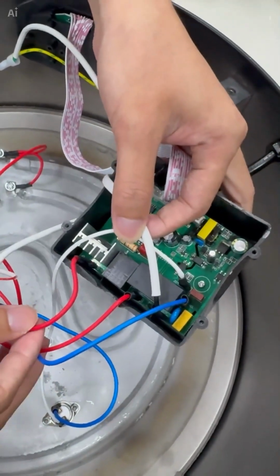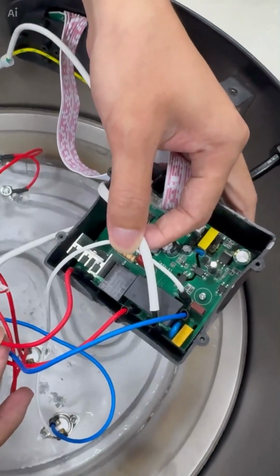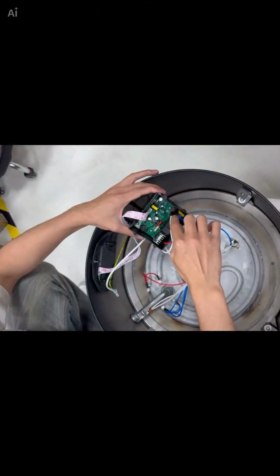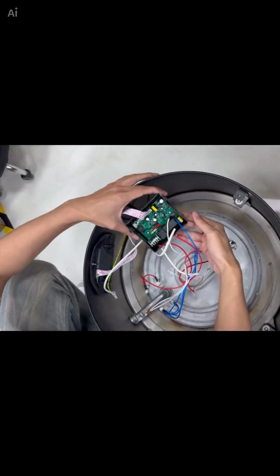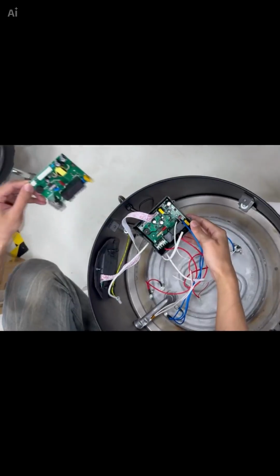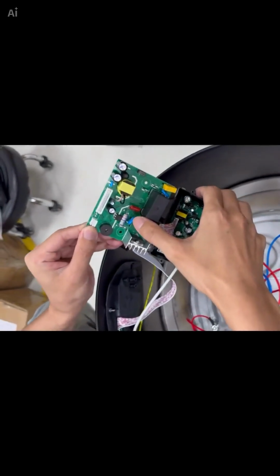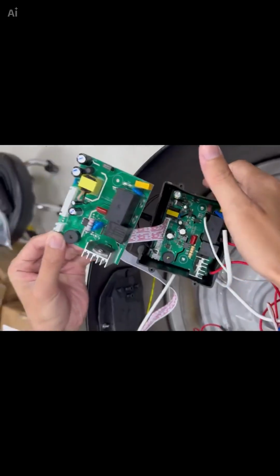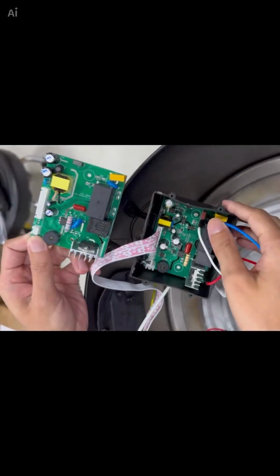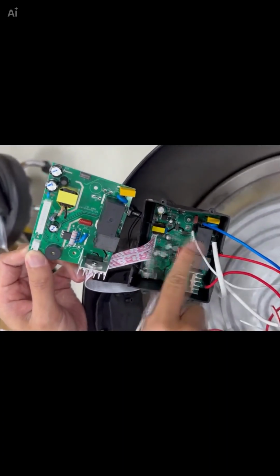The other colored wires can be inserted according to their original positions. This is the specific schematic diagram of the circuit board we just disassembled. Then we will need to replace this circuit board onto here, meaning to swap this one with this location. Then, for the specific wiring method, unplug this white wire and plug it here.